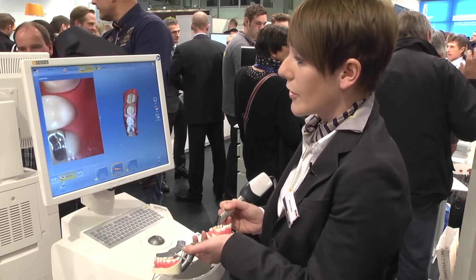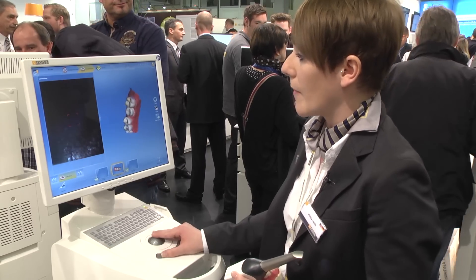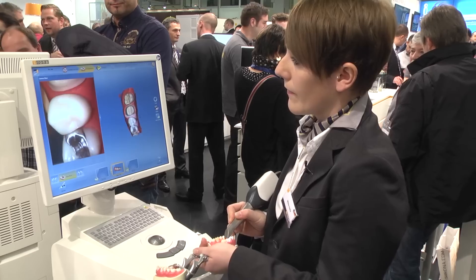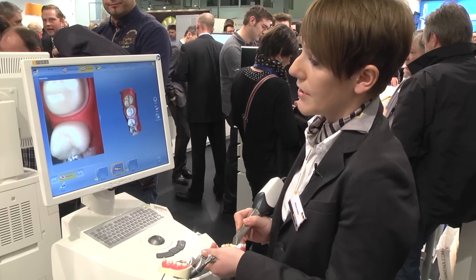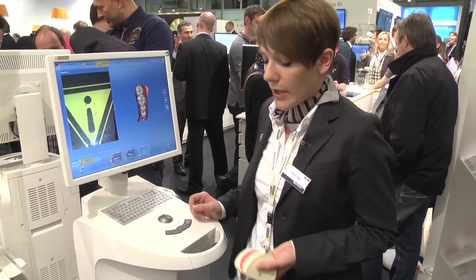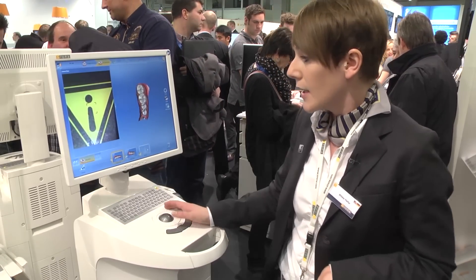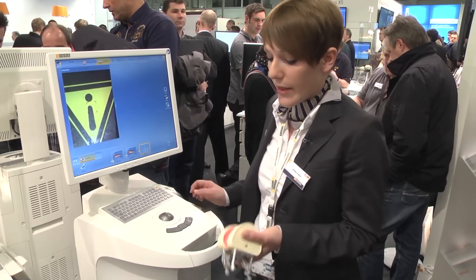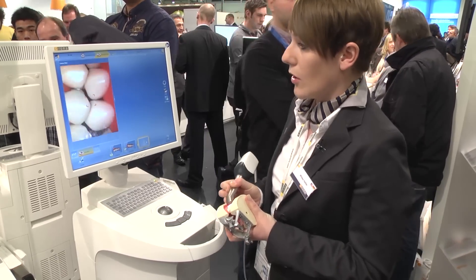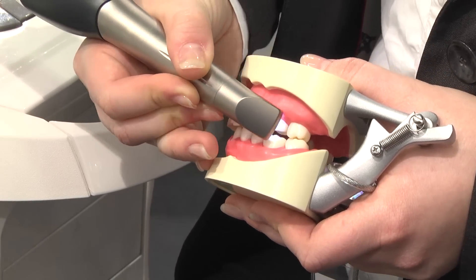If there are still some areas missing — like here from the proximal — we just go over and start screening those areas as well. We also need information from the buccal scan to understand how both arches belong together, so we open the buccal window and make a video of the buccal area.